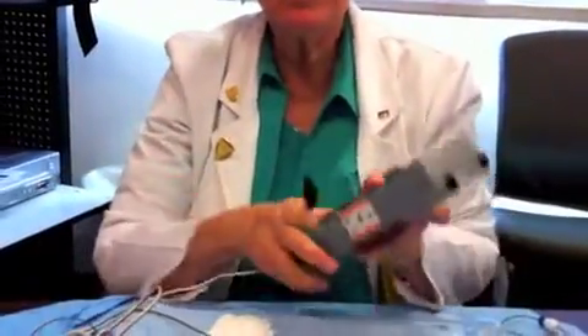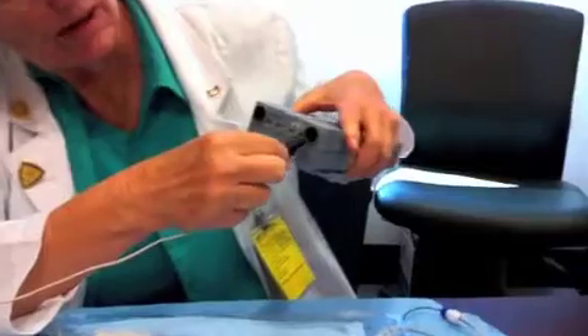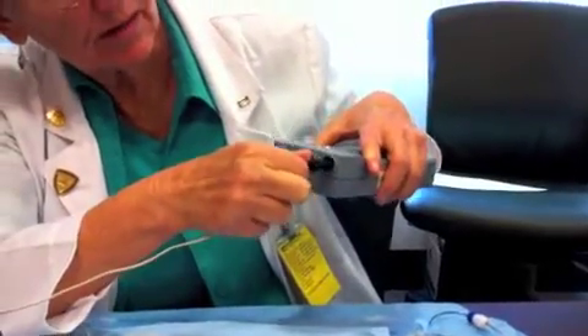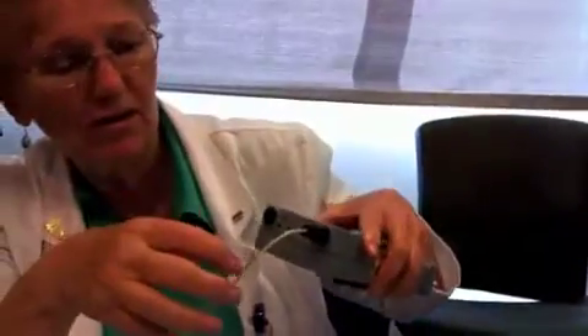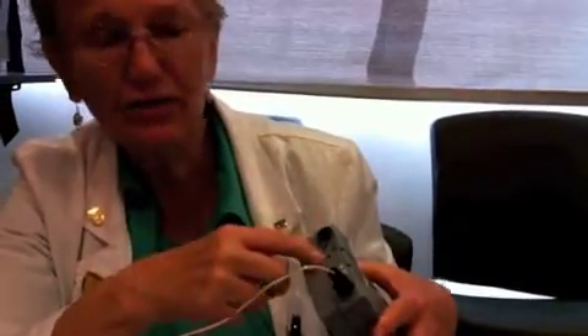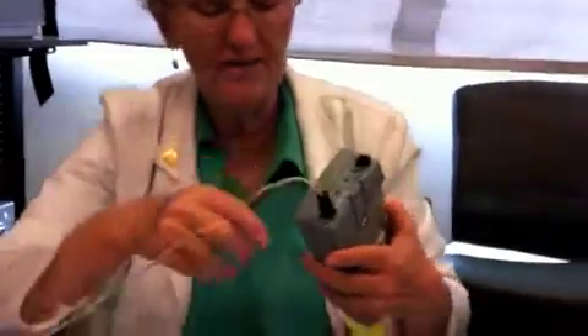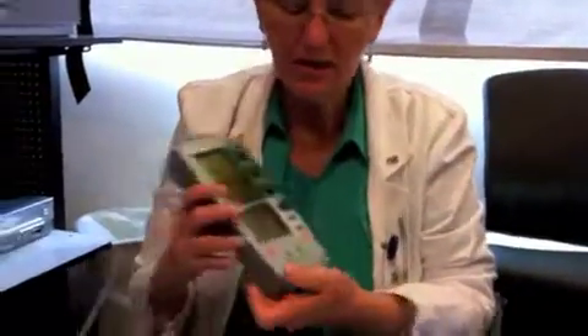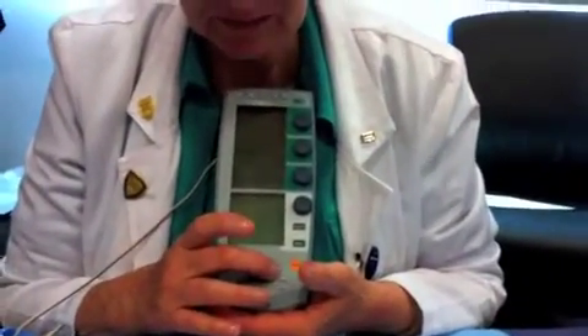The bridging cable gets plugged into the V here — V for ventricle, A for atrium — but you're going to plug it into the V. Then you can turn this pacemaker on.